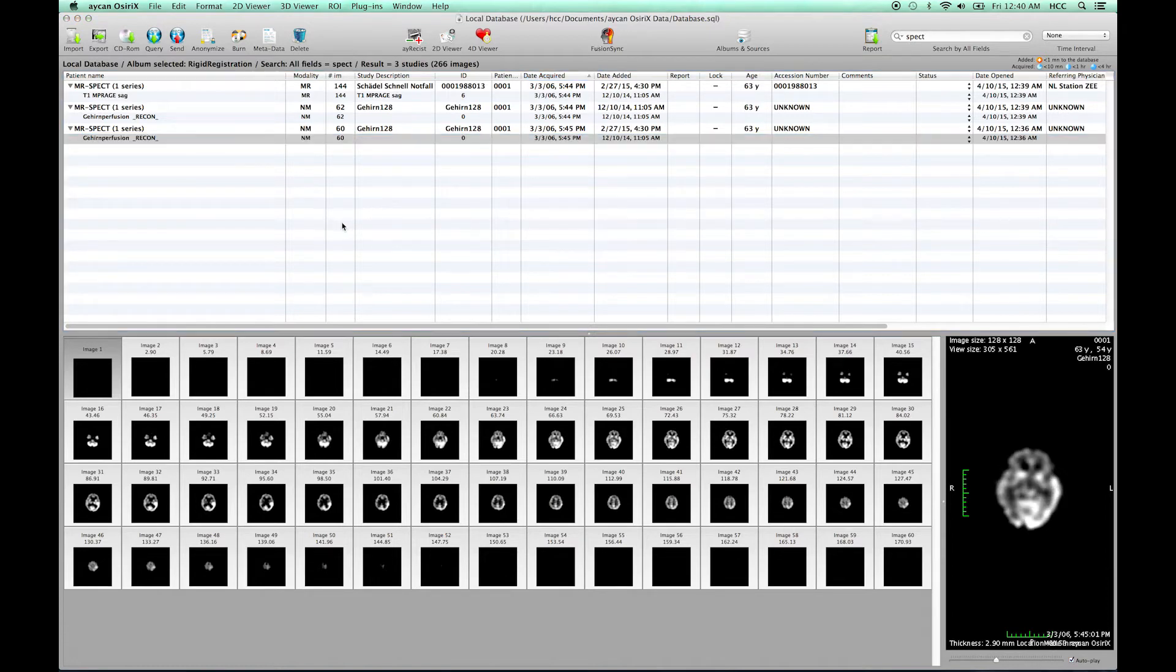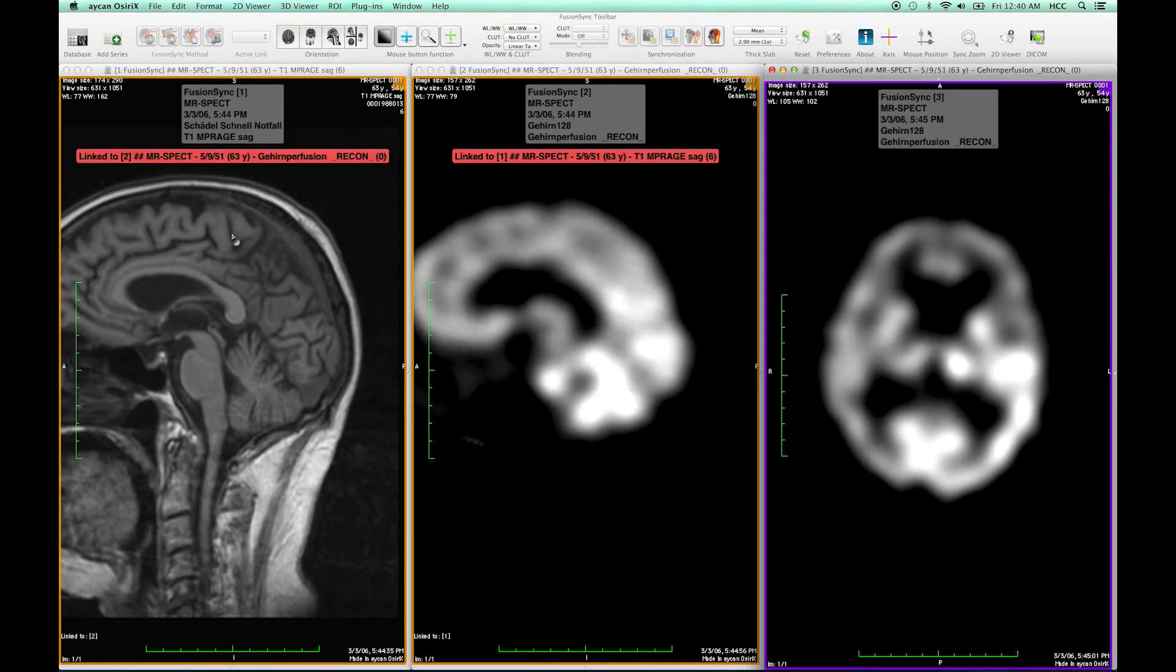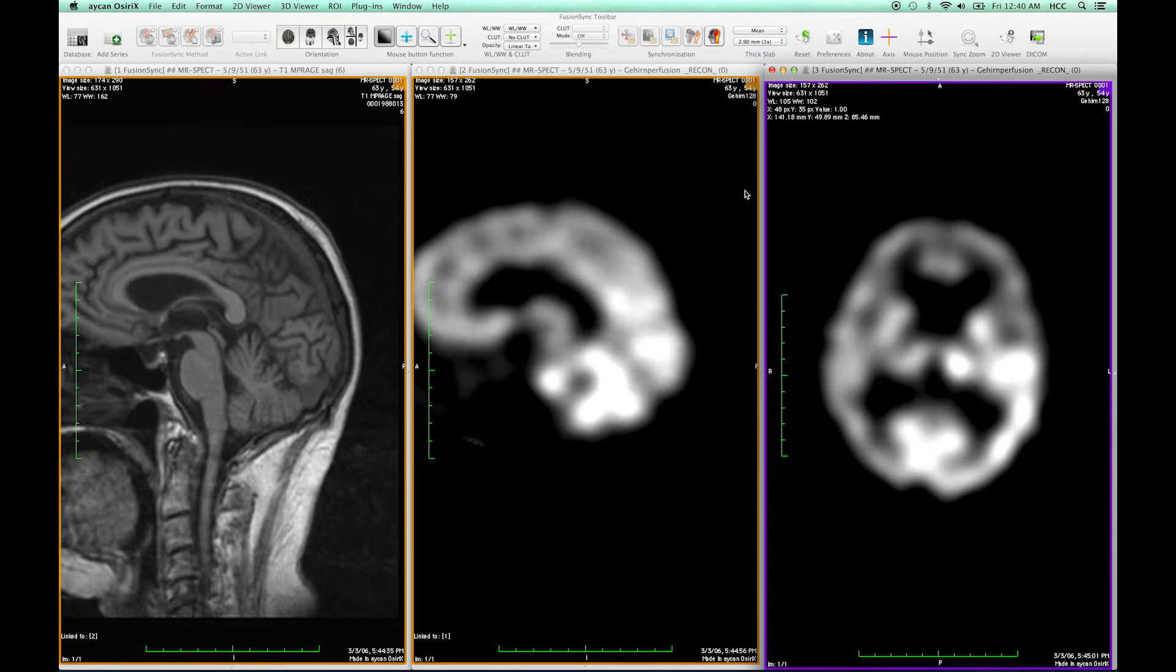And note for added series the links have to be established manually. Here I can see the MR image is linked to the first SPECT image which have been loaded previously but the new one isn't.